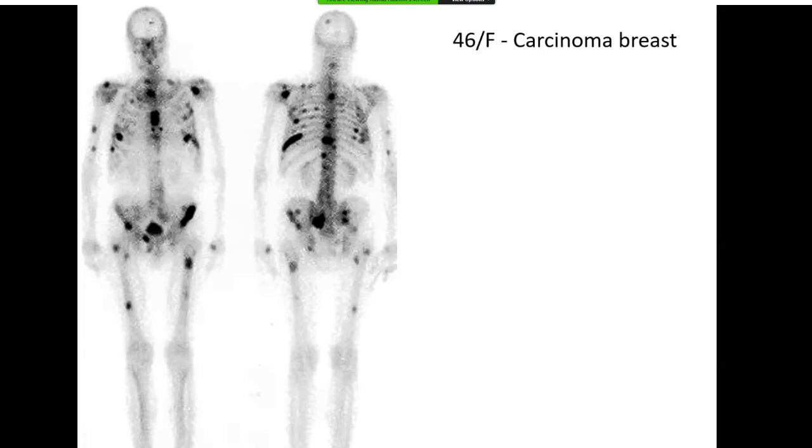Okay, so just a point of clarity. When you start to see focal, fairly discrete areas of increased uptake, the pattern would not be of a super bone scan. So these would be just widespread metastases. The pattern is different from the previous one because the size of the metastasis and the degree of osteoblastic repair that leads to increased uptake varies from patient to patient.